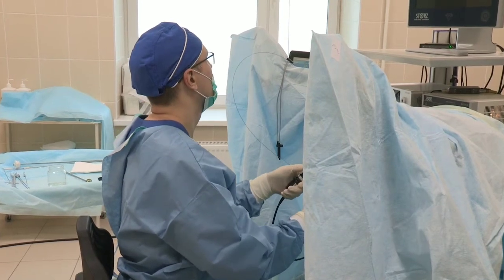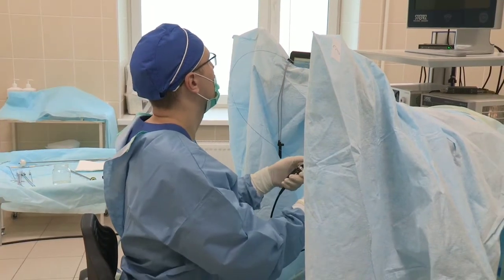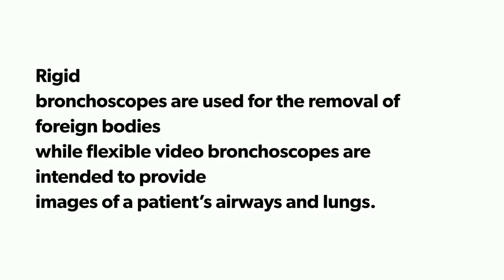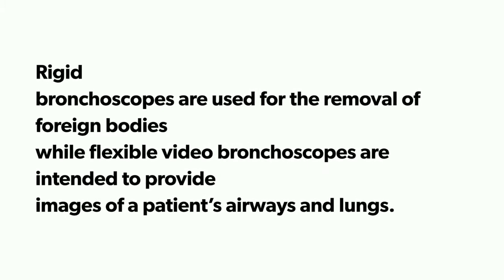So this bronchoscope is inserted into the airways, usually through the mouth or nose. Sometimes the bronchoscope is inserted via tracheostomy. Rigid bronchoscopes are used for the removal of foreign bodies, while flexible video bronchoscopes are intended to provide images of a patient's airway and lungs.